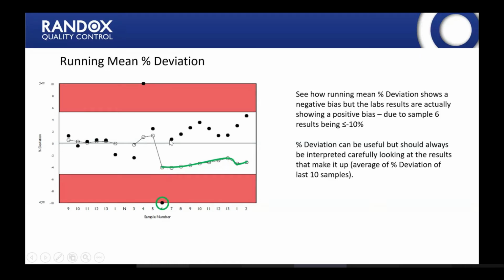But if you actually look at the lab's results, this is the same pattern we saw in the previous, this is the same lab's performance from before. You can see that the results are all running on the positive side of the mean. So if you just look at the running mean, you would think the lab has a negative bias, but if you actually look at the lab's results, the lab is actually running with a positive bias. So most of these results here are all within the acceptable limits, but if you looked at the running mean, you would get a different performance indication than the individual sample results, and it's because of this one result that is being included for the 10 samples it takes, that we're looking at the average of the running mean.